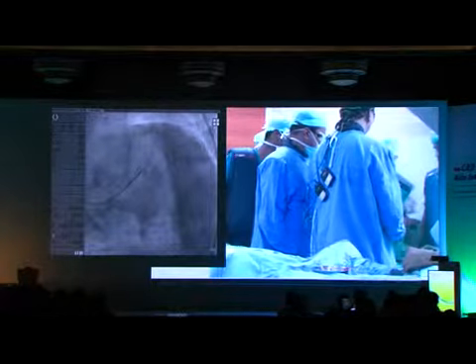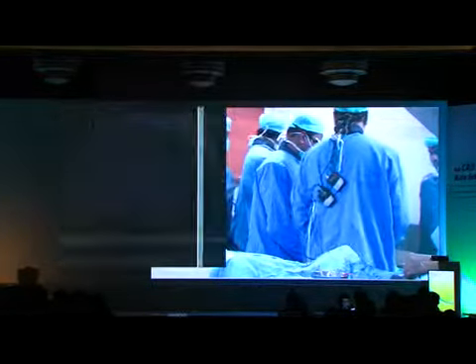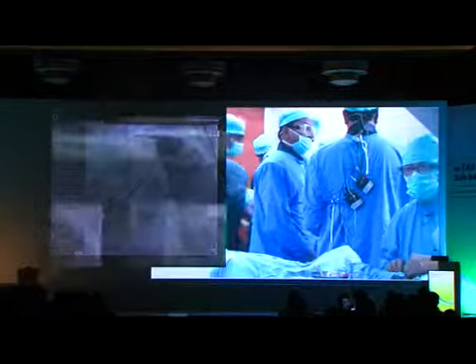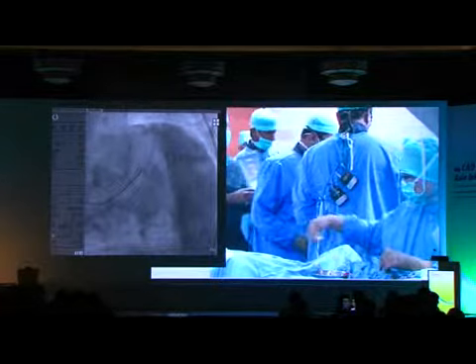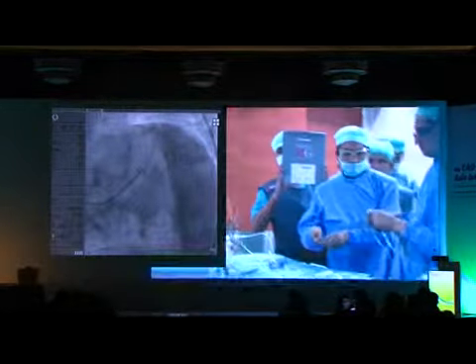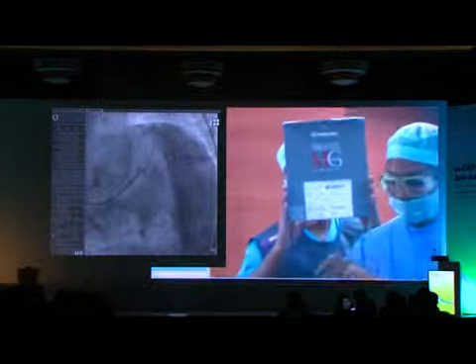Yes, good. Because you see that I'm not progressing. I'm entering the lesion but not progressing.